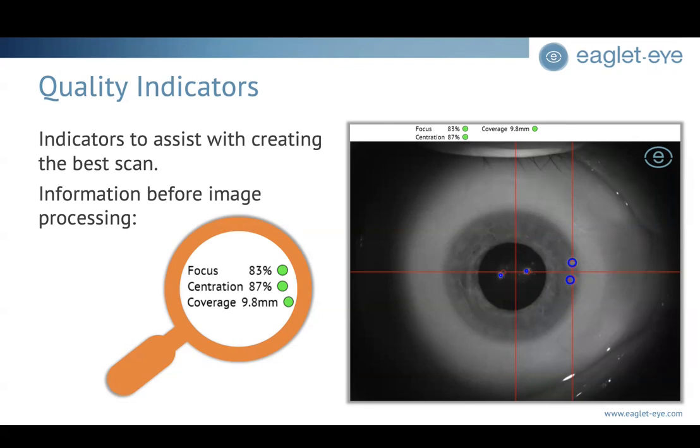Another little tip and trick that I'll give when we're getting the patient aligned: you can pull the forehead back, or pull the chin back to rotate the eye and give a little bit more real estate. If, say, they have really deep set eyes on the top, if you roll back or roll forward, depending on where there could be an eyelid cutting off the data, that will help a lot to get the lids out of the way really cleanly.